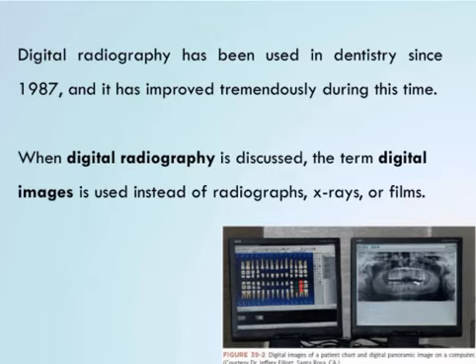and it has improved tremendously over time. The digital radiographs that were available before and now, the quality is very much improved. The precision and the sharpness have also improved, and we have more diagnostic tools to find out the changes related to the teeth.